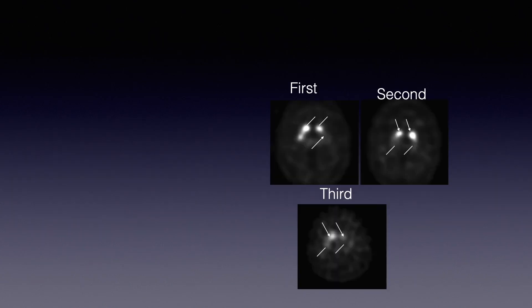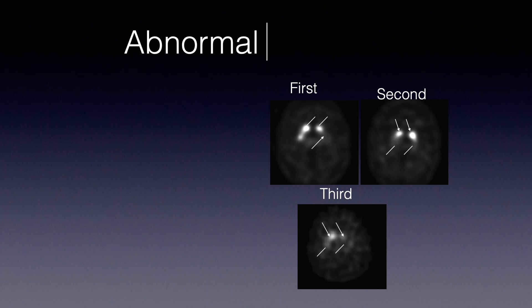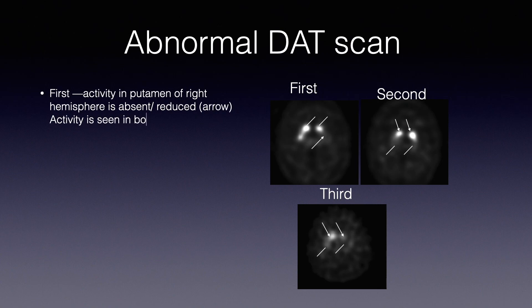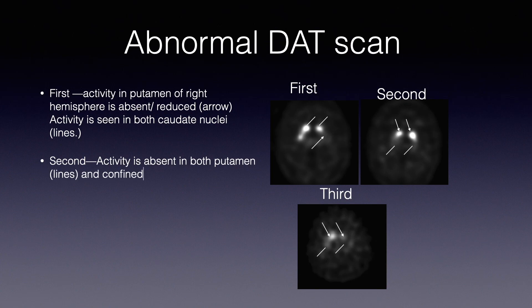The following three images demonstrate an abnormal DAT scan. The first image demonstrates activity in the putamen of the right hemisphere which is absent or reduced, as shown by the arrow, while activity is seen in both caudate nuclei, shown by lines. In the next image, activity is absent in both the putamen, as shown by the lines, and confined to the caudate nuclei, as shown by the arrows.